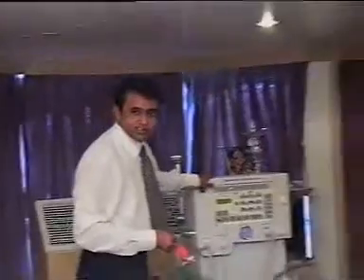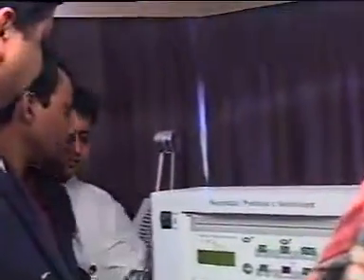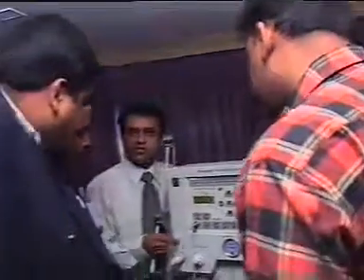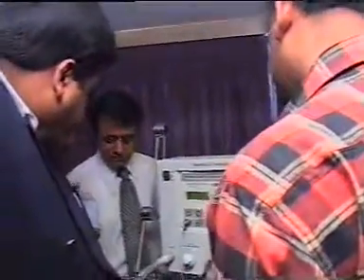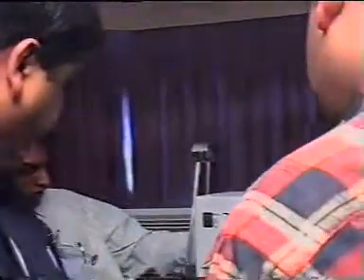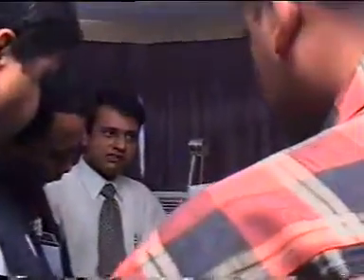Now, you have seen the ventilator? But a lot of technology is involved inside that. If you see the front part of the ventilator, let's come closer. There is always something written as 'to patient'. The air gas blender, the blended gas and oxygen mixture, is supposed to go to the humidifier. That has not been shown here. From the humidifier to the patient interface device, that is the endotracheal tube.